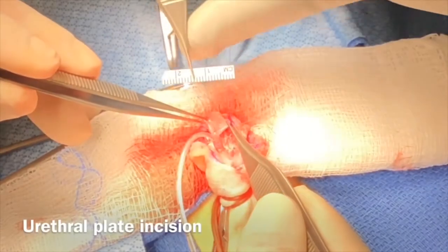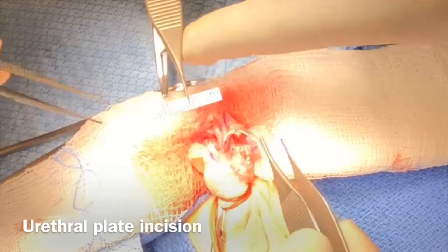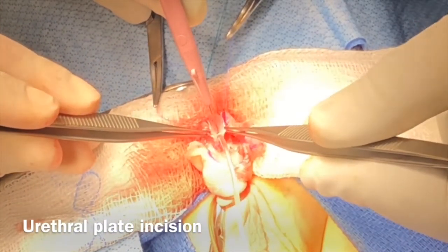The urethral plate is incised dorsally so as to relieve the tension on the future neo-urethra.